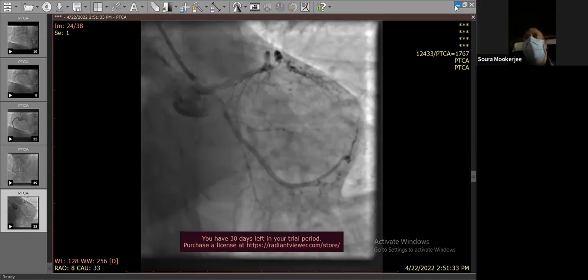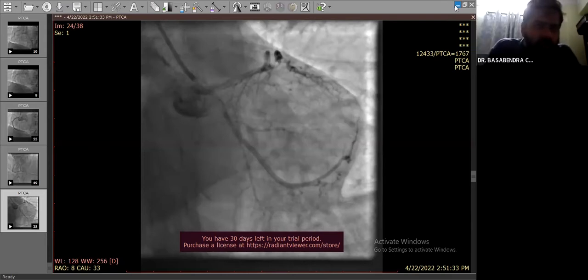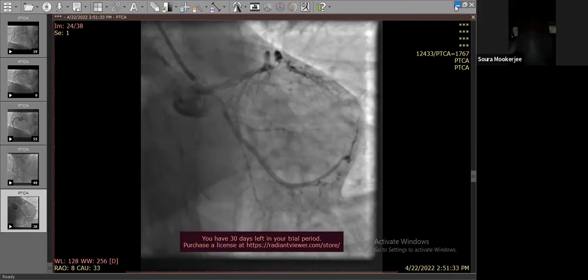So you took a check shot, you said. Yes. So how many times did you repeat the check shot? Because you said that finally you took another check shot. But was that really mandated? Because already you had subjected the patient to a pretty good amount of dye overload because of the lengthy process. But once you had confirmed that the tip was already inside the catheter, you had already successfully retrieved it and you didn't cause any considerable damage. So I think the final shot of the left side was not really mandated. Okay. Anyway, you did it. There's no objection to it as such.